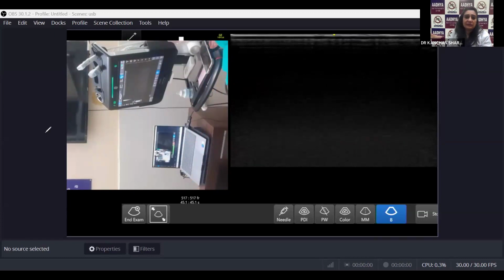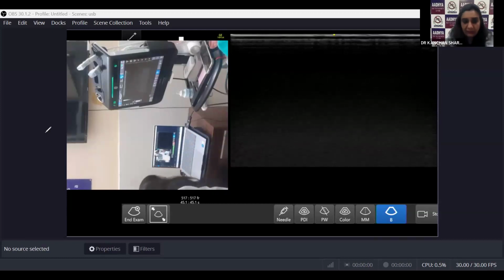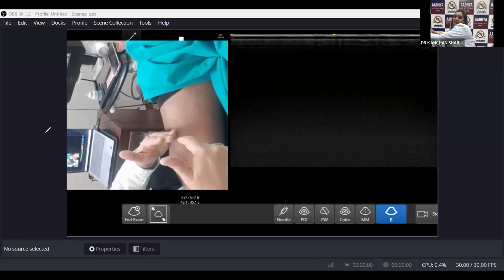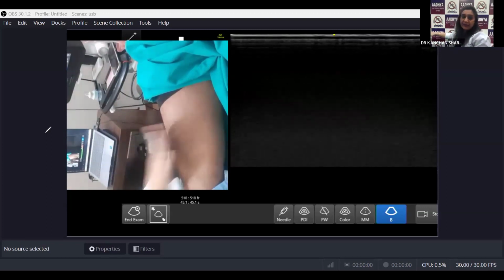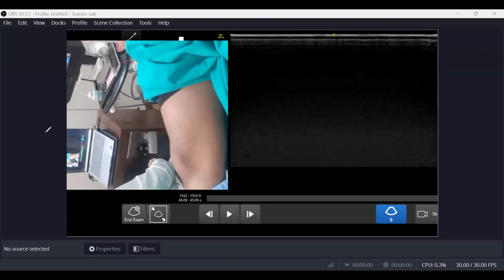Yes. Regarding the suprapatellar approach for the suprapatellar recess, can we go from the medial and the lateral side, or only from the lateral side? I prefer lateral, but yes, people go from the medial side also. I do not like going from this side. You can put your probe and go from this side as well. But the recommended side is the lateral one, not the medial side. And from the lateral side, any concern regarding the iliotibial band?